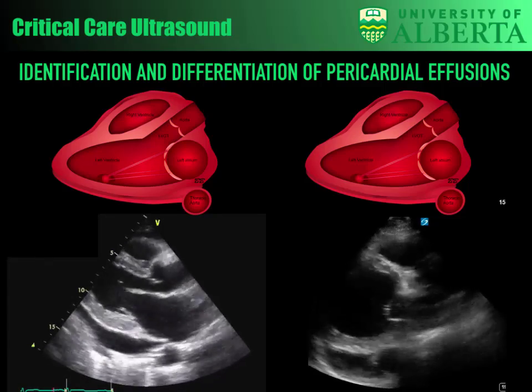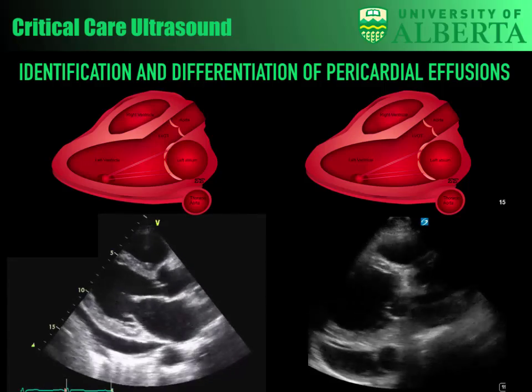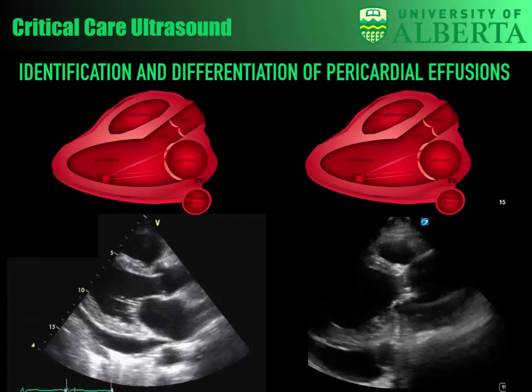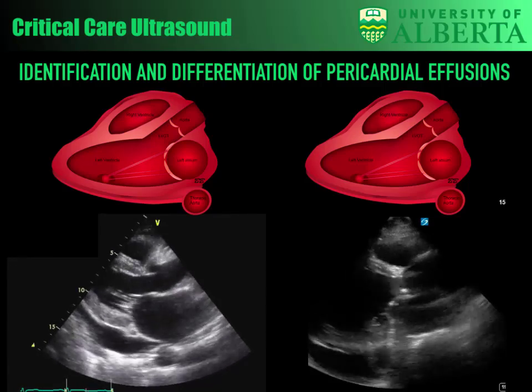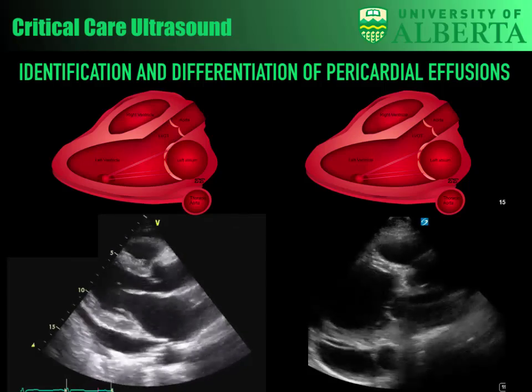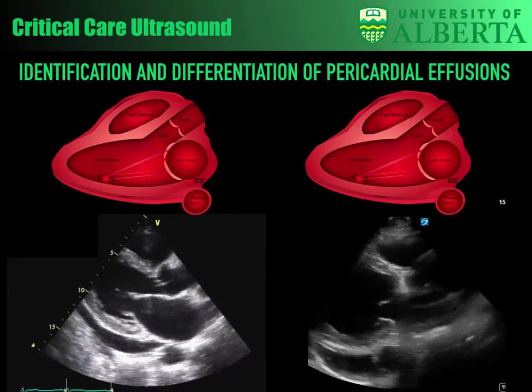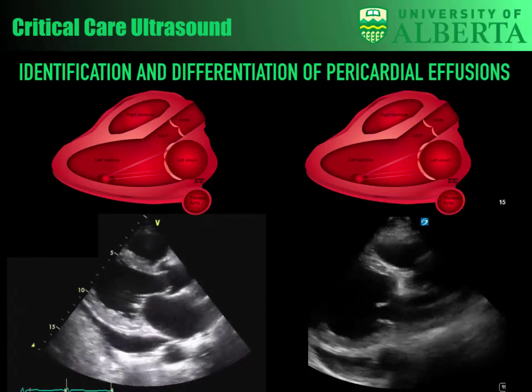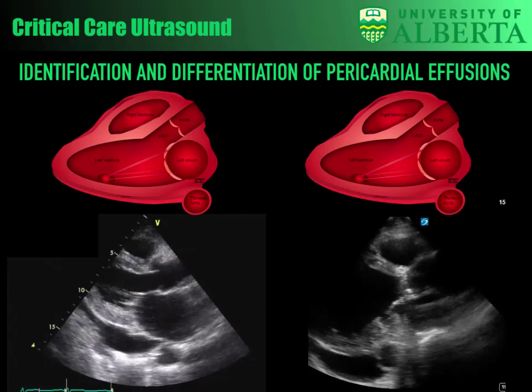So this is one important feature, which as you do more and more of this, you'll recognize, and with time the signal becomes more distinct. When you're in the heat of the moment and looking to see if this is an important contributor to a patient's clinical status, I would urge you to really take your time. If you're not certain, you can ask your colleagues, talk to cardiology, because it can be very difficult. Patients can have suboptimal windows, they can have massive pleural and pericardial effusions, and it can be extremely hard to differentiate what those pathologies are.